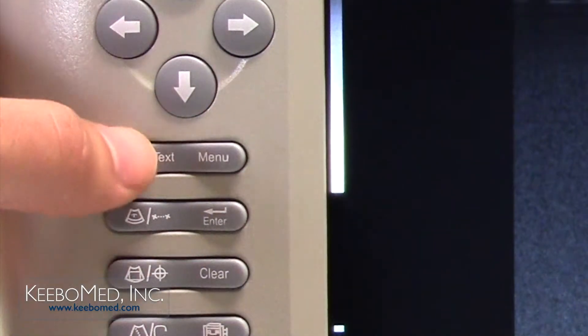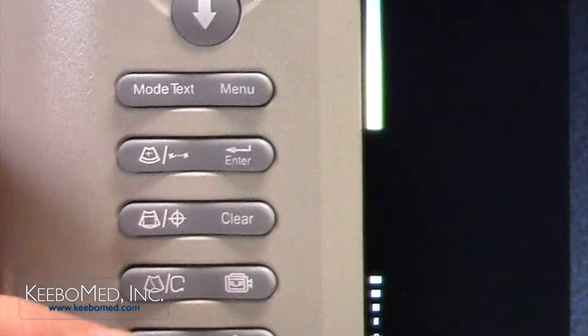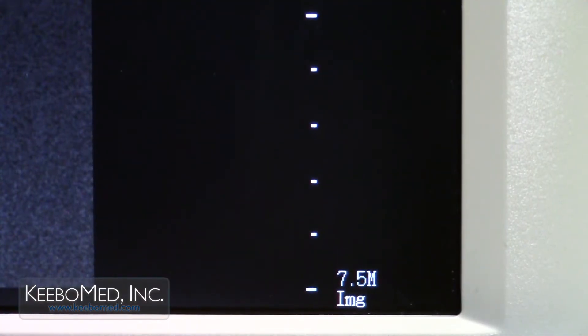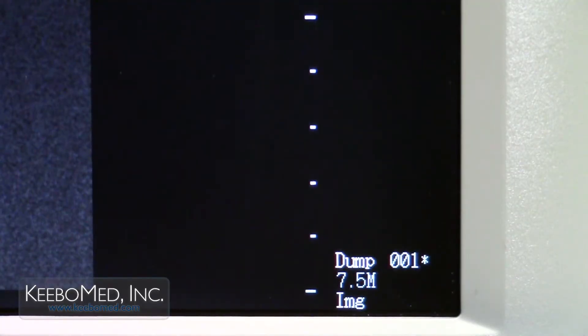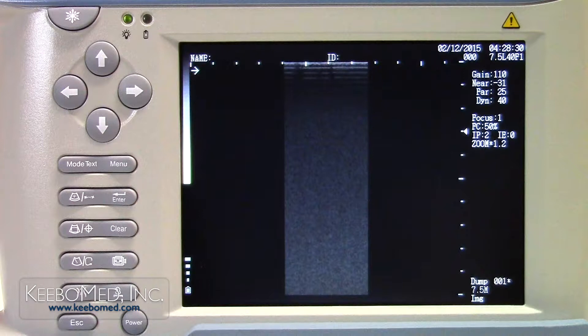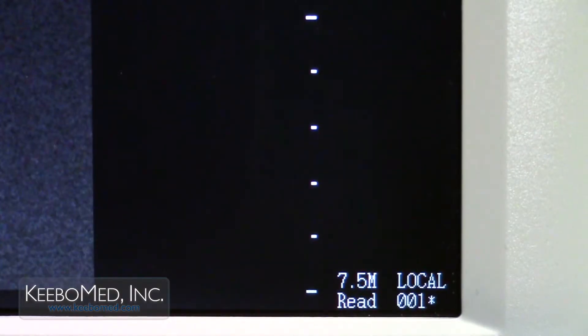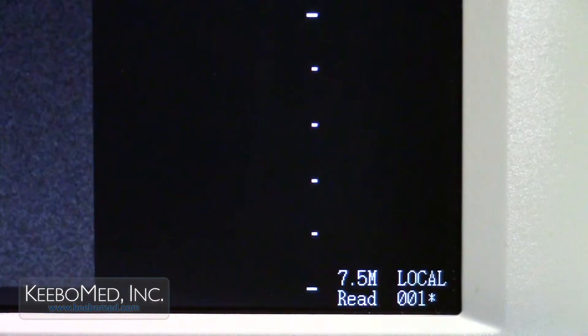Step 5. Press the mode key and a dump prompt will appear along with the image code that will be transferred. Step 6. Press the enter key and the dump prompt will disappear. The dump prompt and the image code will reappear with an asterisk. This indicates that the image has been imported to the USB drive. Step 7. To make sure the image successfully transferred, press the escape key and the local disk prompt is displayed. Press the mode key to switch to the USB drive. U-Disk is now displayed and will show the successfully transferred image.